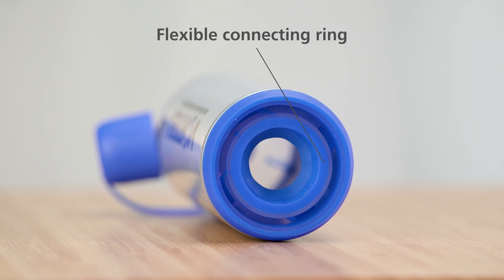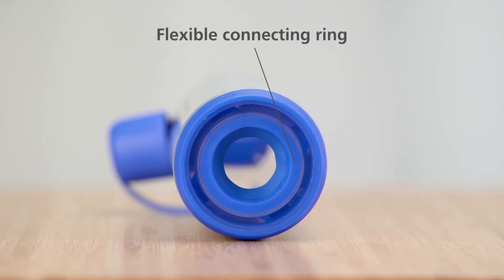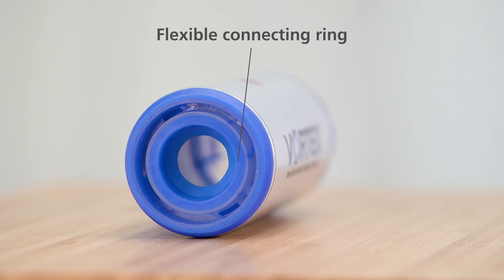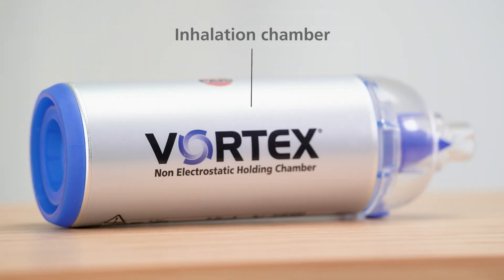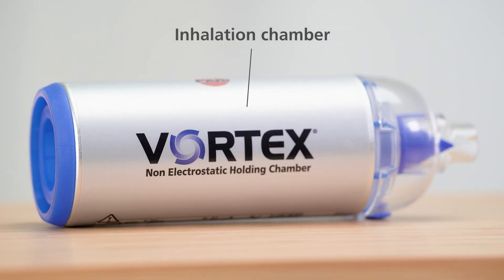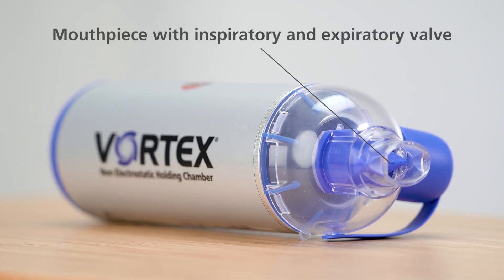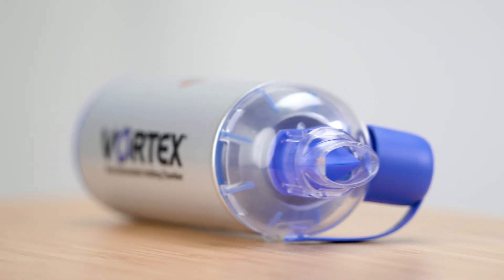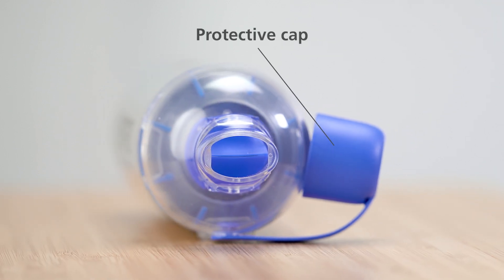All Vortex devices have a flexible connecting ring that's suitable for use with most standard metered dose inhalers. The inhalation chamber is made of aluminium and is anti-static. The removable mouthpiece features an inspiratory and expiratory valve and can be covered with a protective cap.